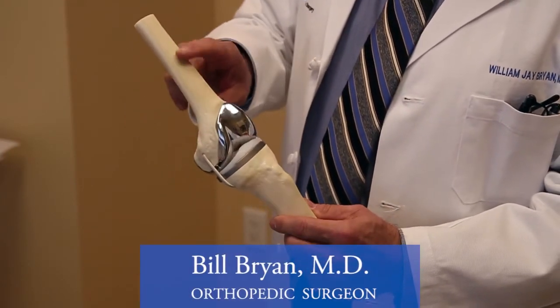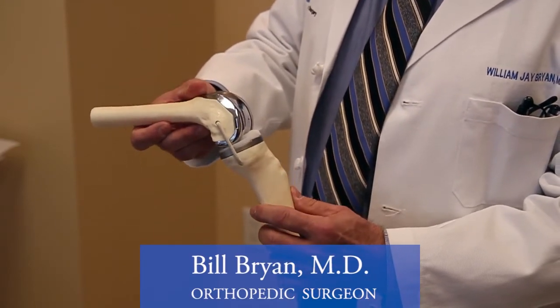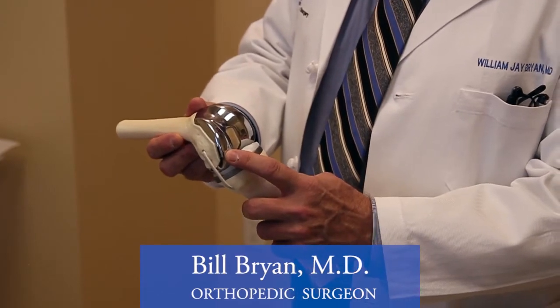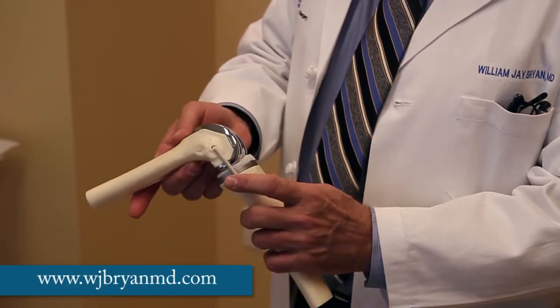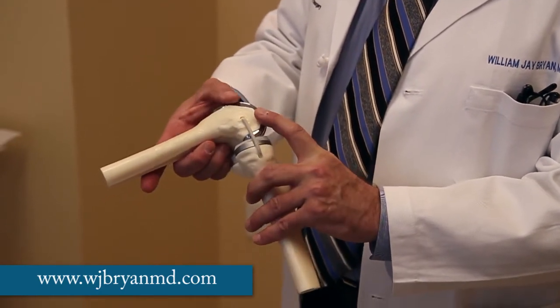This is the femur, the thigh bone, and the femoral component, which is made either of chrome cobalt steel or ceramic, is fitted over the end of the femur after the surgeon makes very precise cuts on the bone.